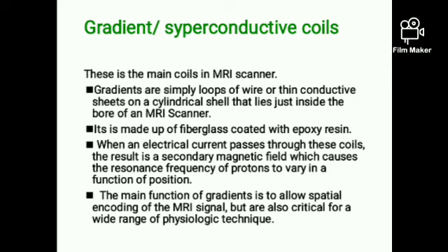phase encoding means whether the gradient is coming from frequency, meaning long FOV, or whether it is coming from short FOV, that is phase encoding, or what will be my slice selection, like narrow slice thickness or wide slice thickness. So all these things will be decided with the help of the gradient coil, and the main purpose of the gradient coil is to give you a better quality of image.